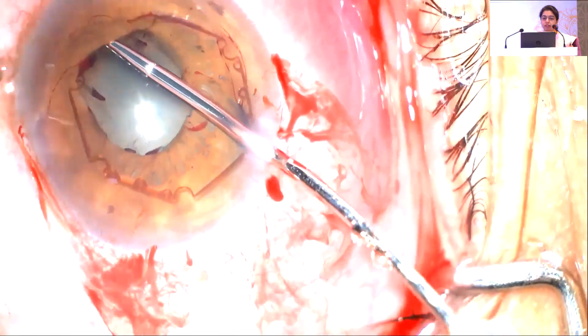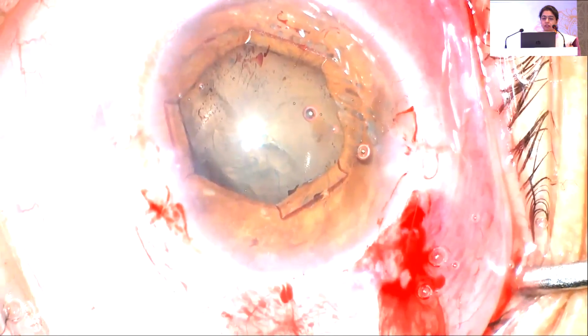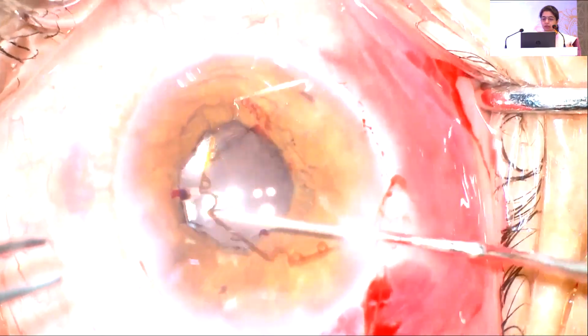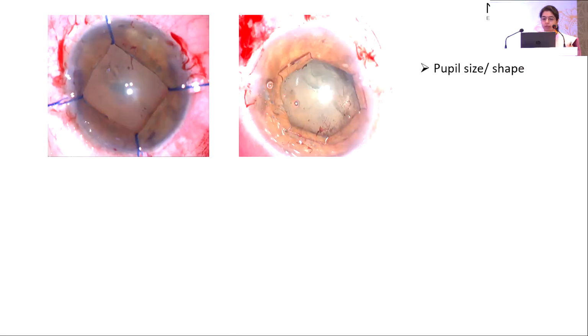I don't have any financial interest. It has flanges and notches, which have to be inserted in the pupil. And again, removing is also very straightforward. Once you learn the procedure, it's very easy to do. And again, removing the viscoelastic thoroughly from behind the IOL.